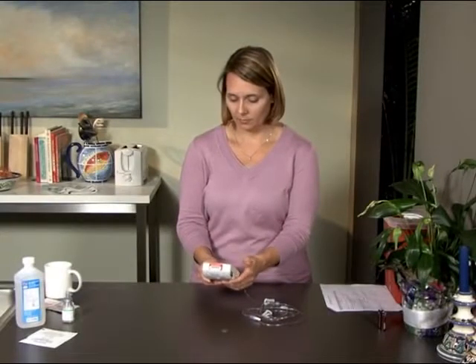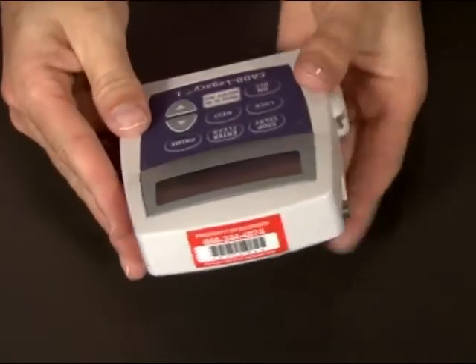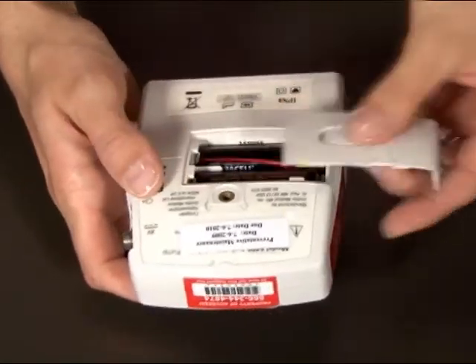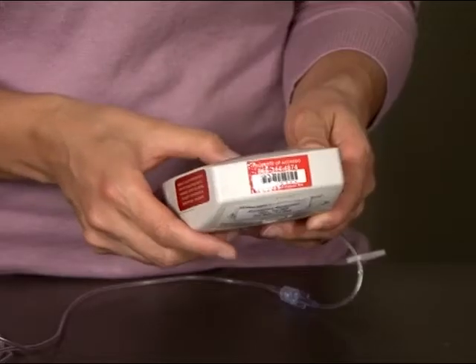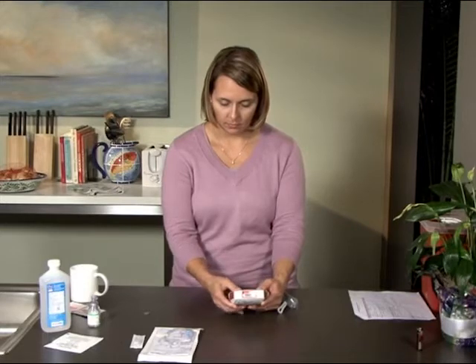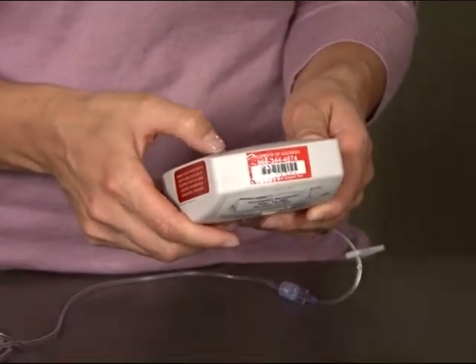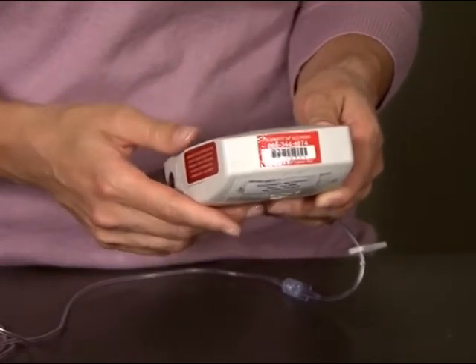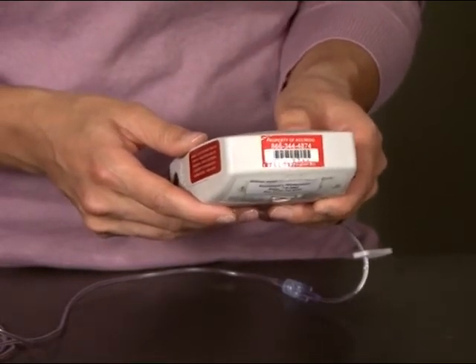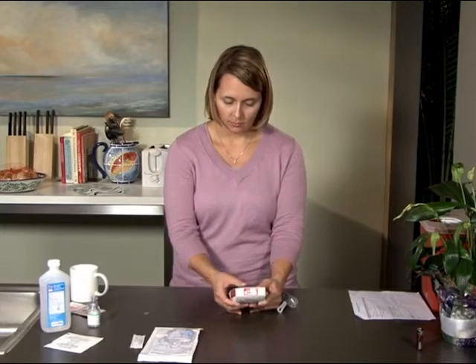Now that your medication is mixed and ready, it's time to set up your CADD Legacy 1 pump. Begin by pressing the on/off button — the pump will be in stop mode. Before continuing, change your batteries if it's time for your weekly battery change. Once you have new batteries in your pump, check to see that the pump is still in stop mode, then press the next button. The first option on the screen will allow you to set your reservoir volume. Use the up or down arrows to change the volume, then press the enter/clear button. While your cassette reservoir holds 100ml, we suggest setting the reservoir volume at 96ml. This way, the empty cassette alarm will sound when the cassette is not quite empty, giving you a bit of extra time to fill a new cassette.